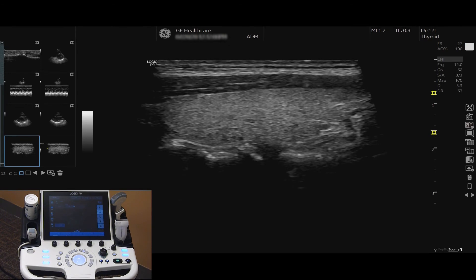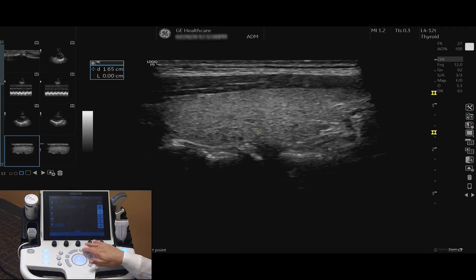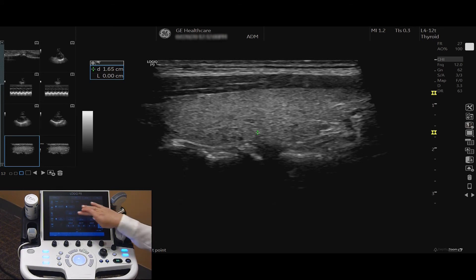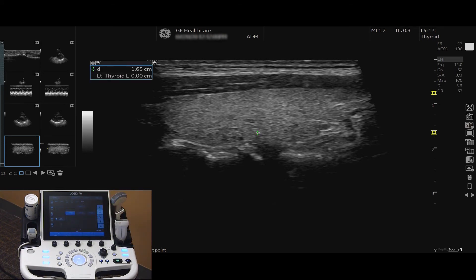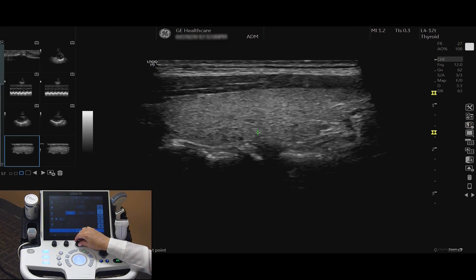To add a measurement into the caliper package, press Measure. Your touch screen will display various measurement options according to your application and preset. Select the measurement that you would like to complete. In this case, I will measure the thyroid length. To change the side, tap the side option on the touch screen or turn the rotary dial.